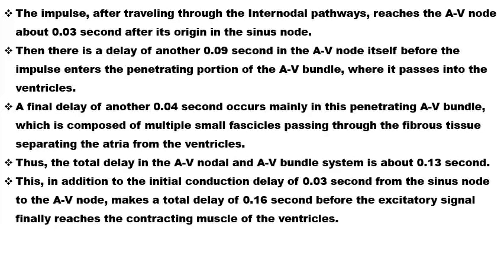So 0.03 plus 0.13 second is equal to 0.16. This is somewhat the PR interval. The range is between 0.12 to 0.2 second.